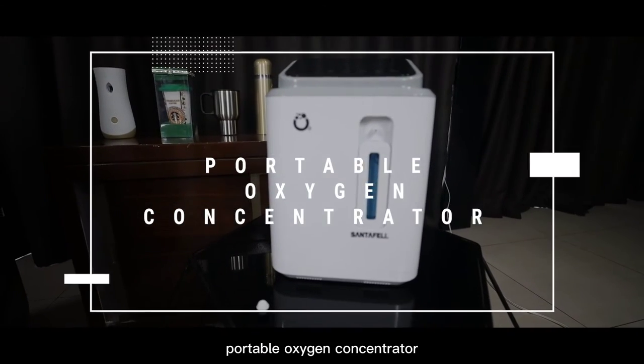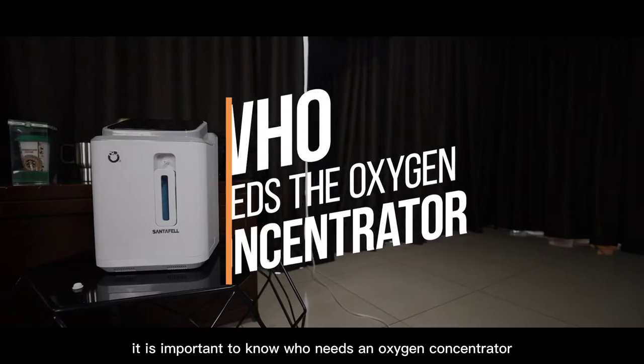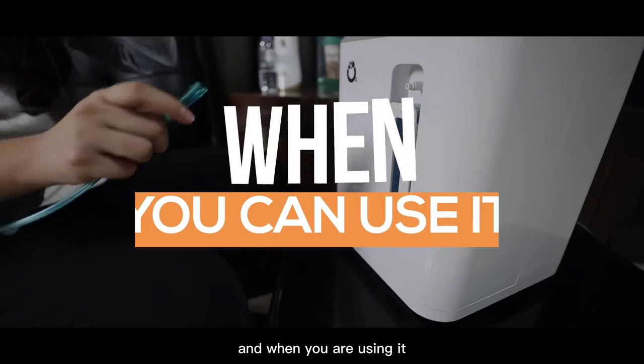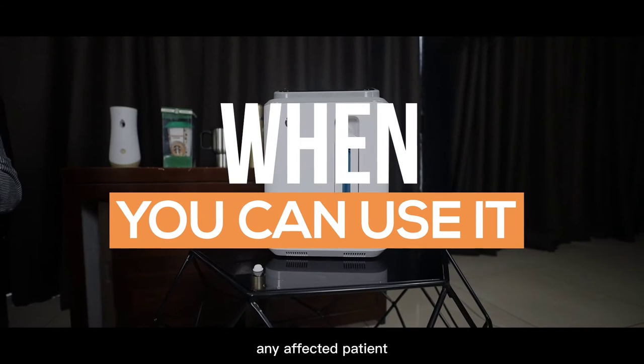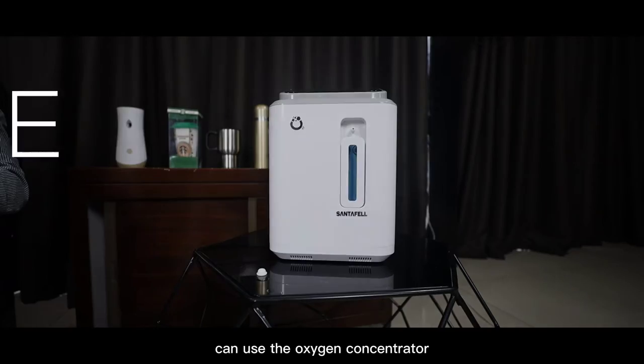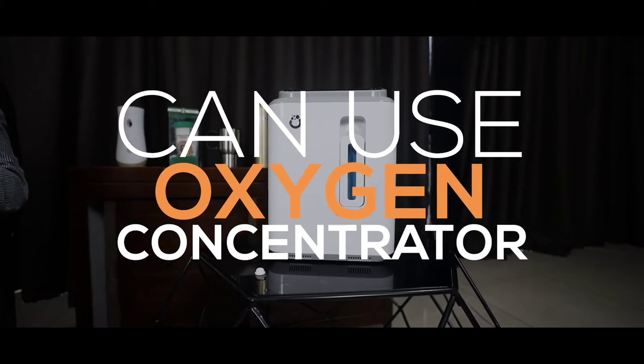Portable Oxygen Concentrator. It is important to know who needs an oxygen concentrator and when you are using it. Any affected patient who is dealing with breathing issues can use the oxygen concentrator.